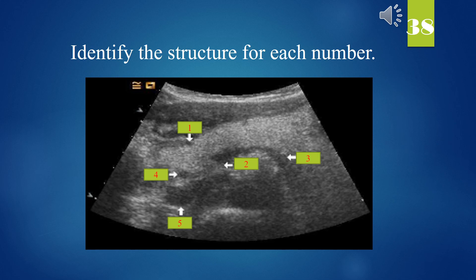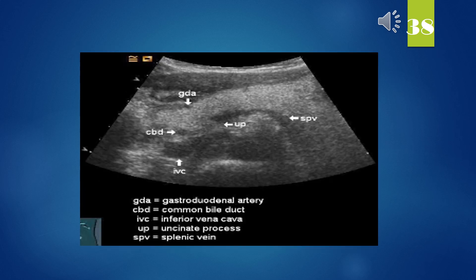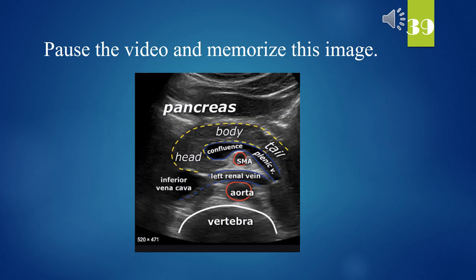Identify the structure for each number. Pause the video if you need. 1. GDA — Gastroduodenal artery. 2. UP — Uncinate process. 3. SPV — Splenic vein. 4. CBD — Common bile duct. 5. IVC — Inferior vena cava. Pause the video and memorize this image.